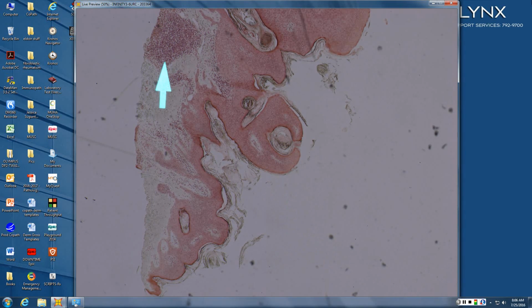So is this A, irritated, or B, inflamed? Inflamed. What's the difference? Inflamed means you see lymphocytes in the dermis, and irritated means those little squamous eddies and spindling. The classic experiment is you take croton oil and paint it on a seb. The seb becomes red, but when you biopsy it, there's not a lymphocyte anywhere around. Instead, there is spindling and squamous eddies. So it is irritated, not inflamed.